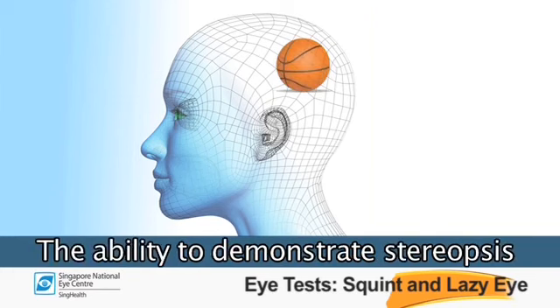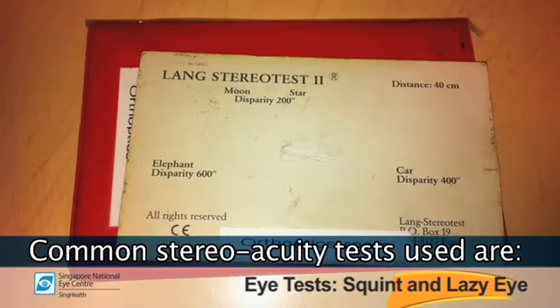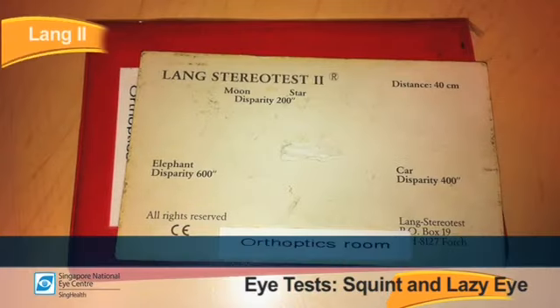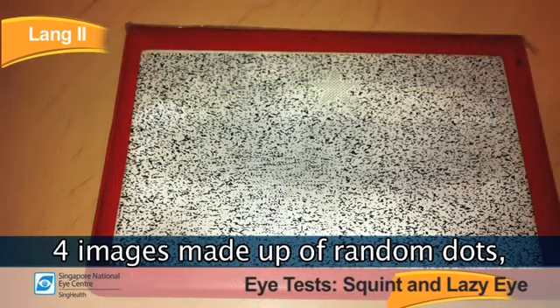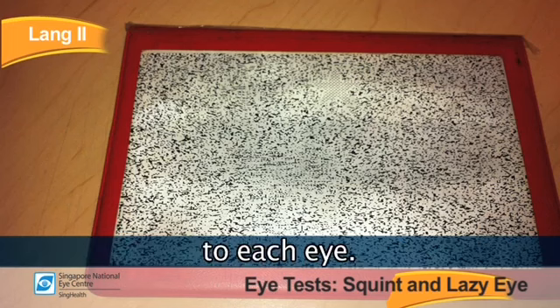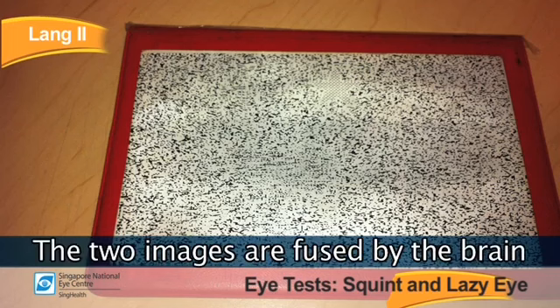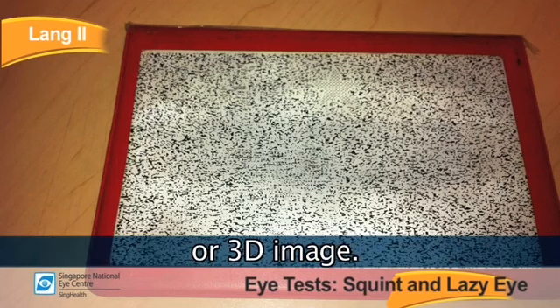The ability to demonstrate stereopsis indicates normal use of both eyes. Common stereo acuity tests used are: the Lang 2 test card consists of 4 images made up of random dots, which present slightly different images to each eye. The two images are fused by the brain to produce a stereoscopic or 3D image.